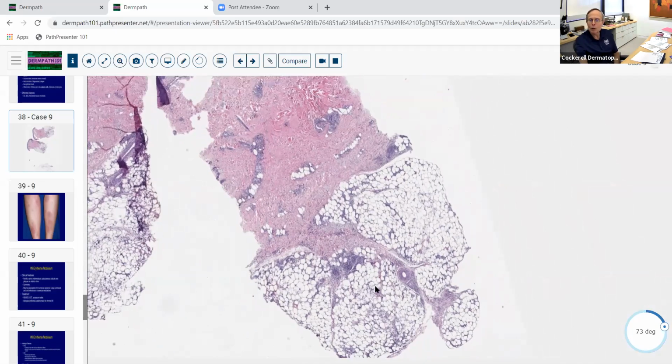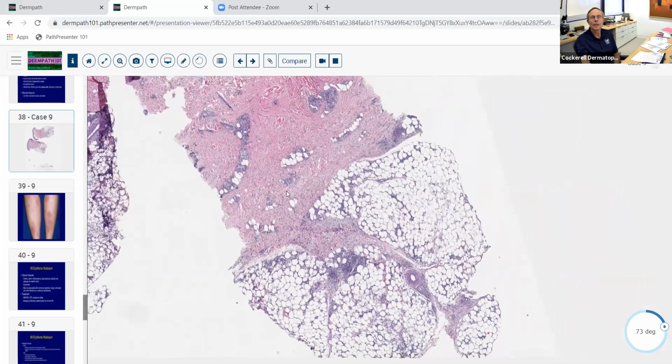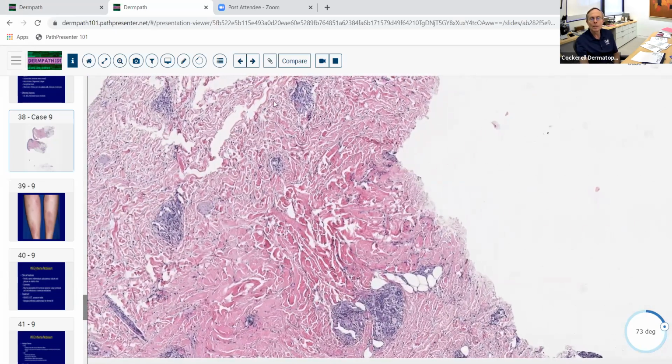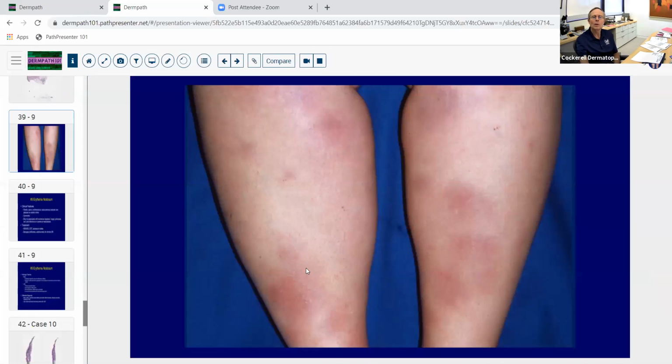This is not erythema induratum. There's no vasculitis. There's minimal involvement of the lobules here. In erythema induratum, you get diffuse suppuration in the lobules coupled with some granulomatous inflammation, and then vasculitis. If you're lucky enough to get it in a specimen, and if you do a punch, you very well may miss that. You may have to take an incisional biopsy to get that. But still, this would not be erythema induratum. And notice that there's not too much inflammation going on in the overlying dermis. A little bit here, but it's relatively rare to get inflammation in the overlying dermis with erythema nodosum.